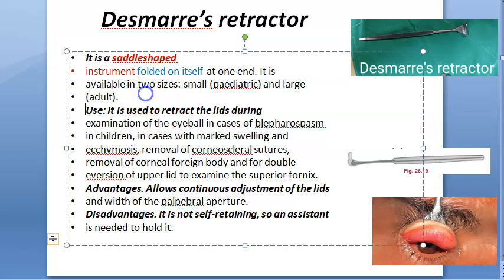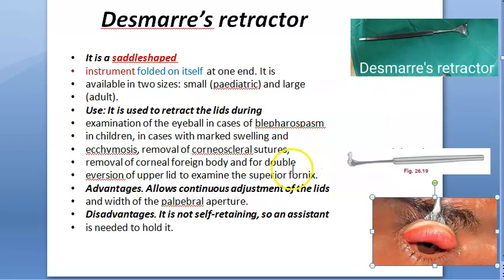It folds on itself at one end. There are two sizes: pediatric size and large adult size. So what are you using it for? You're going to retract the lid during examination of the eyeball — in cases of blepharospasm, marked swelling, chemosis, and a lot of things.